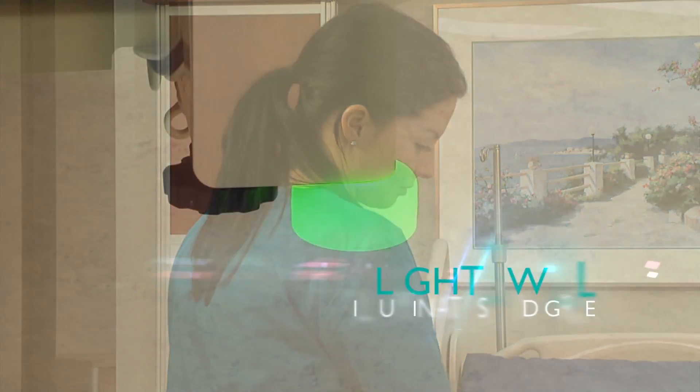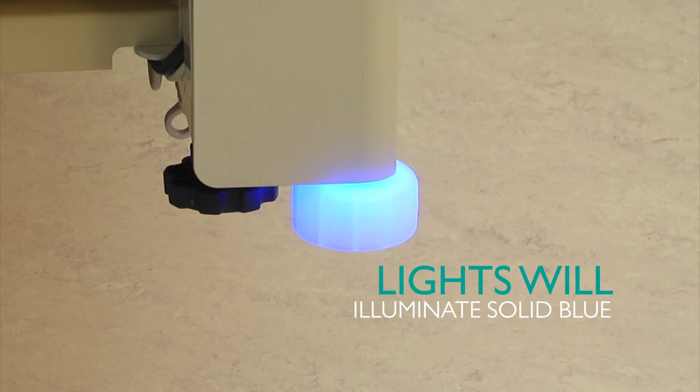If the bed exit alarm is set, Watchdog lights will illuminate solid green. Otherwise, they will be illuminated solid blue.